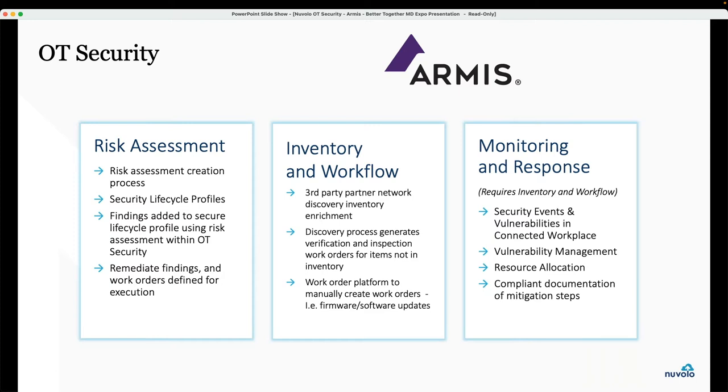When supply chain is sitting down evaluating where this particular model should go, when you're performing a was-is analysis of what you're going to swap to as far as a net new device, this has to be part of the process. Well, before procurement, basically. Yep. But for the existing equipment, then you have to go through the inventory. Correct.